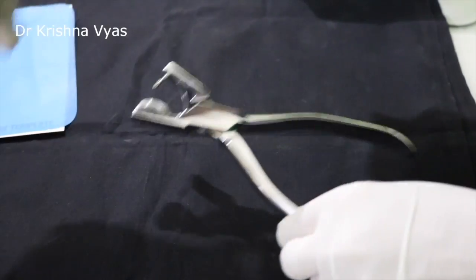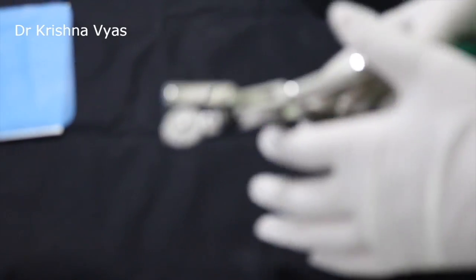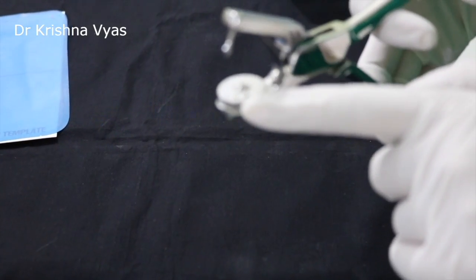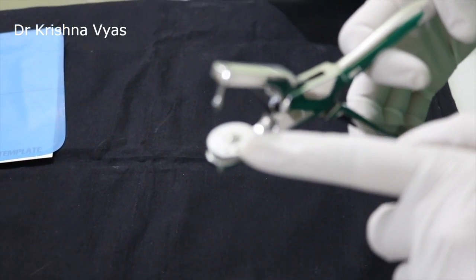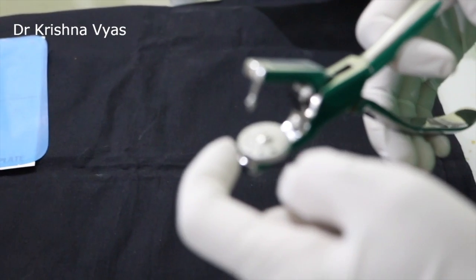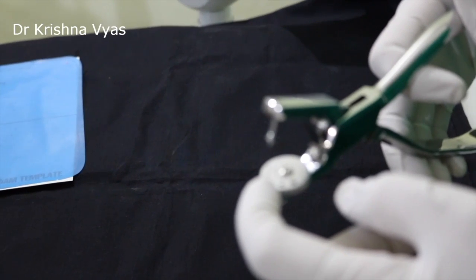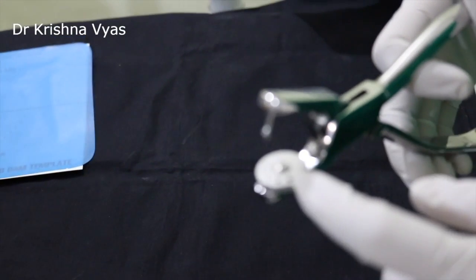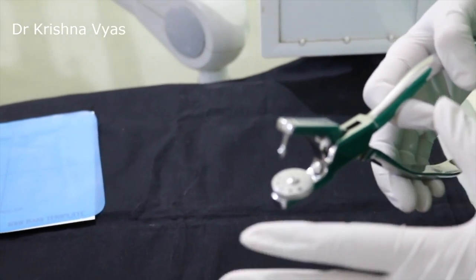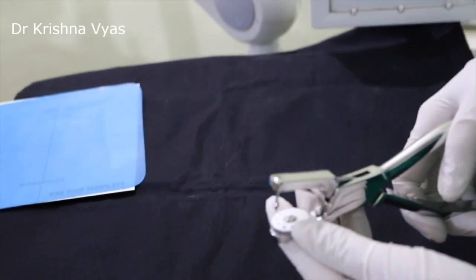Now coming to the rubber dam punch. This is used to make the holes wherever I have marked the dot. It is available with either 5 or 6 holes in different sizes. The smallest one can be used for the mandibular central and lateral incisors, the second one for the maxillary central and lateral incisors, the third one for the canine and premolars, and the last one for the first and second molars. Depending on the size of the tooth we choose accordingly — in this case, since I am going for the premolar, I will go for the third one.